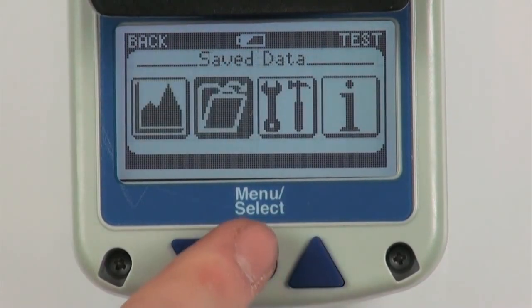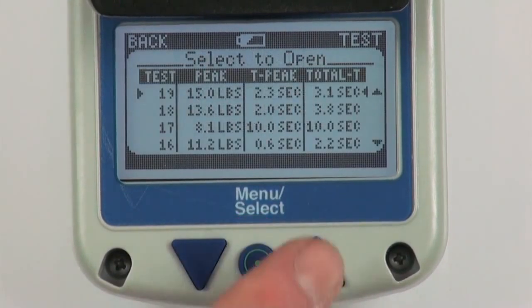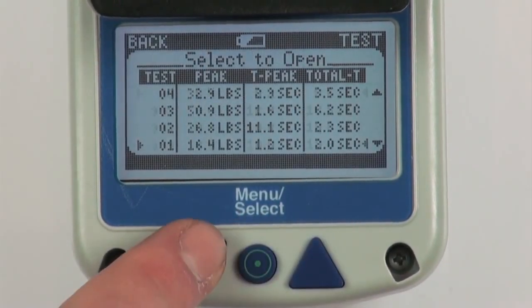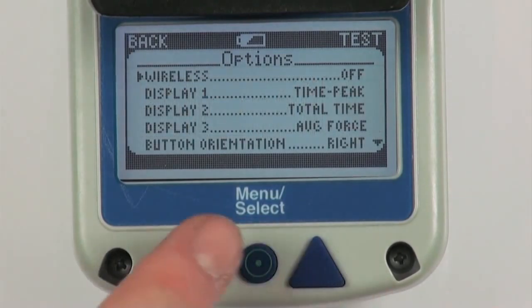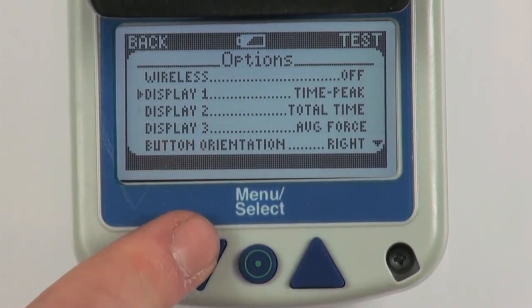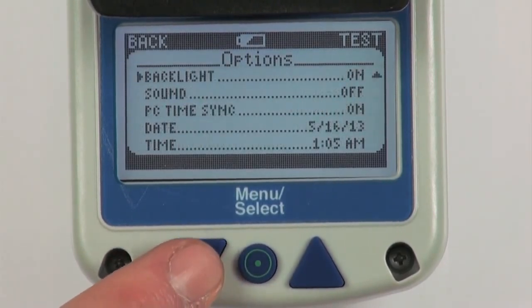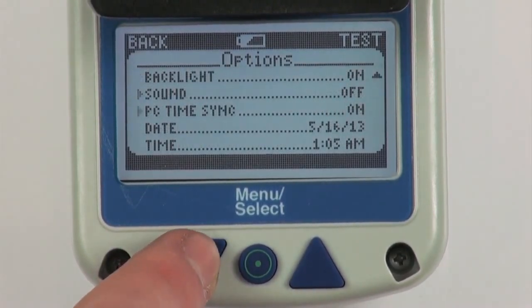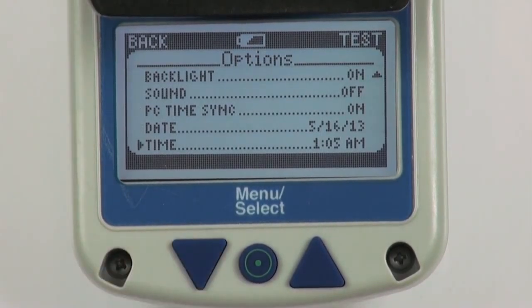The save data menu screen allows users to manage tests that have been saved in internal memory. The options menu allows users to customize the setup of their unit. The display options correspond to the customizable measurement screens on the test screen. With this menu, the user can also set up units, button orientation, backlight, sound, PC time sync, and date and time.